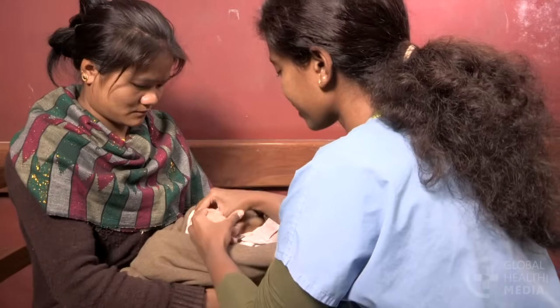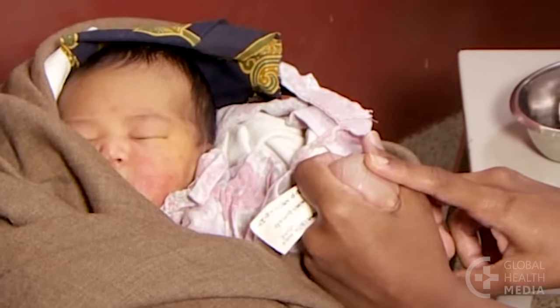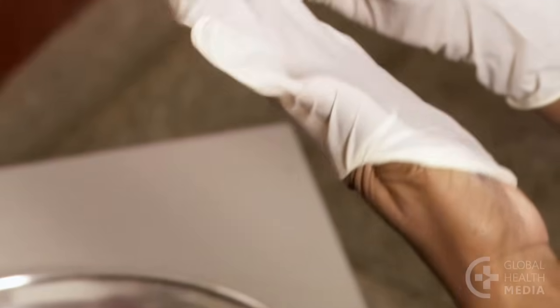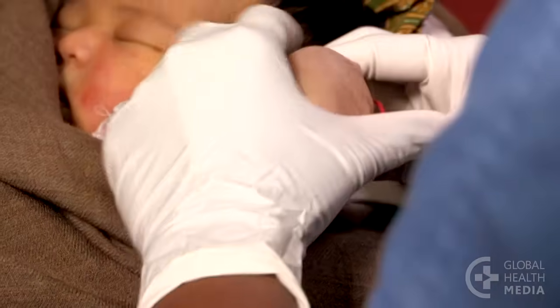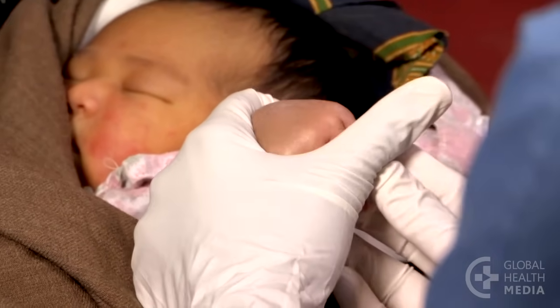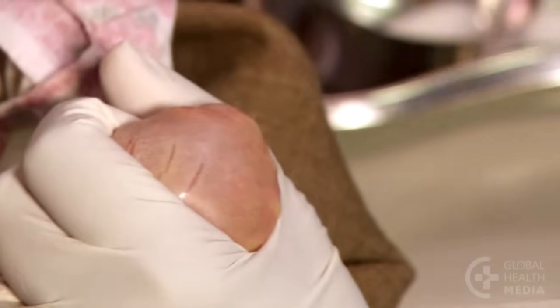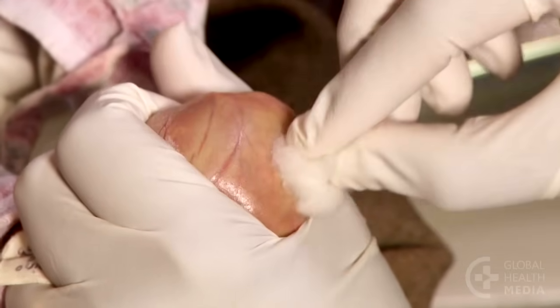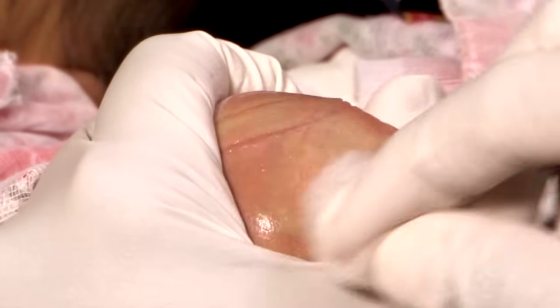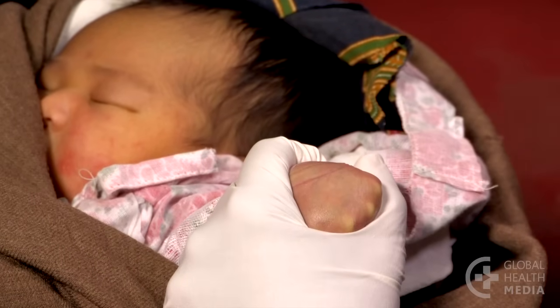Start by finding a good vein in the baby's hand, then put on gloves. Make a circle with your fingers around the baby's hand. Clean the skin from the center moving outward — do this three times — and let the skin dry.